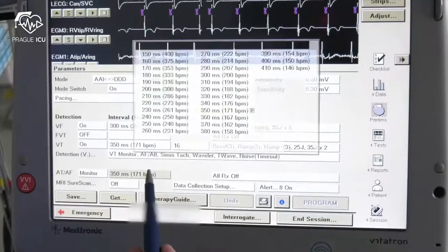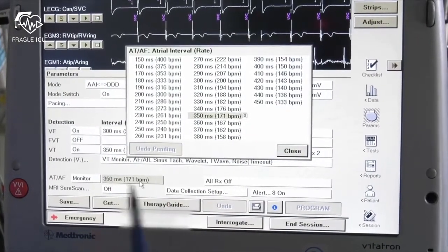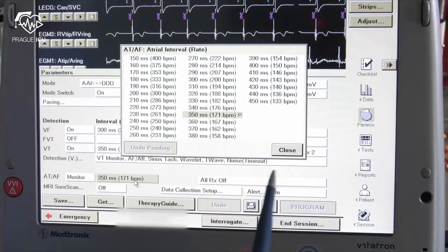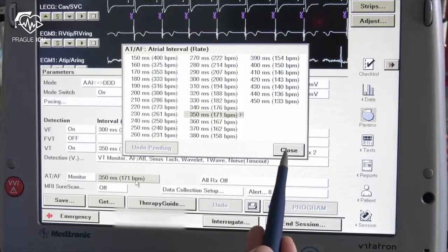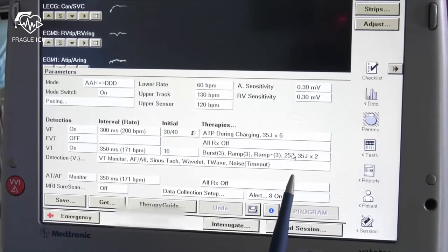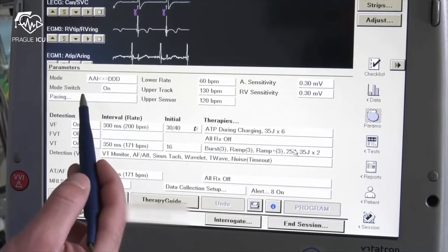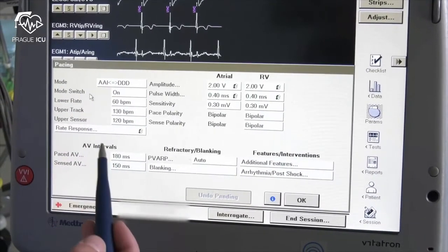In the AT/AF section you can find settings for atrial interval rate, which cooperates with mode switch functions. In the pacing section you can observe general settings for bradytherapy functions of an ICD device.